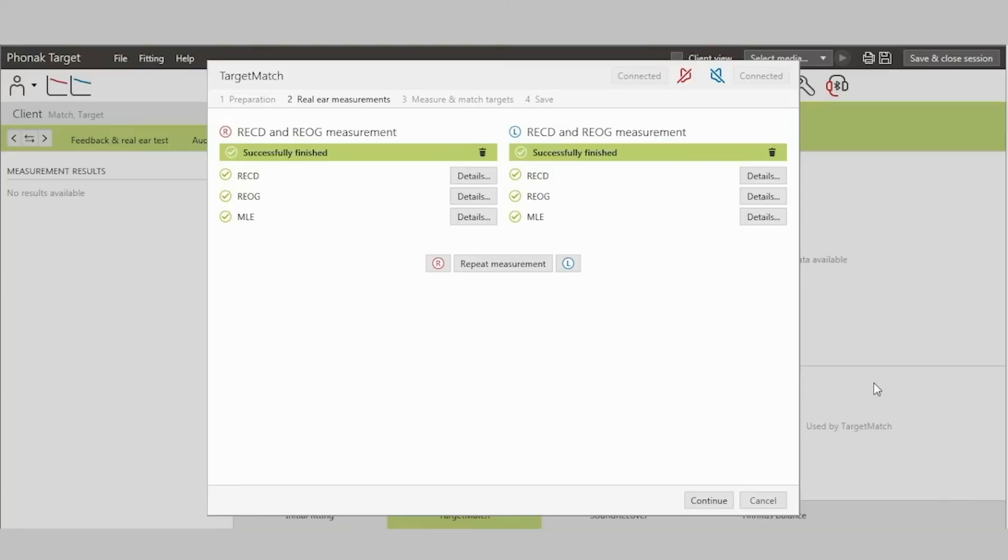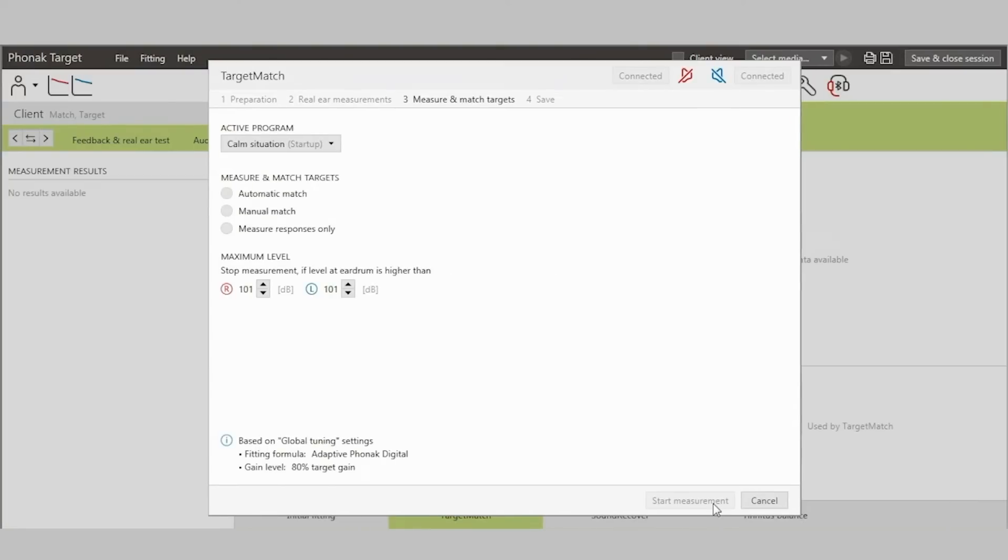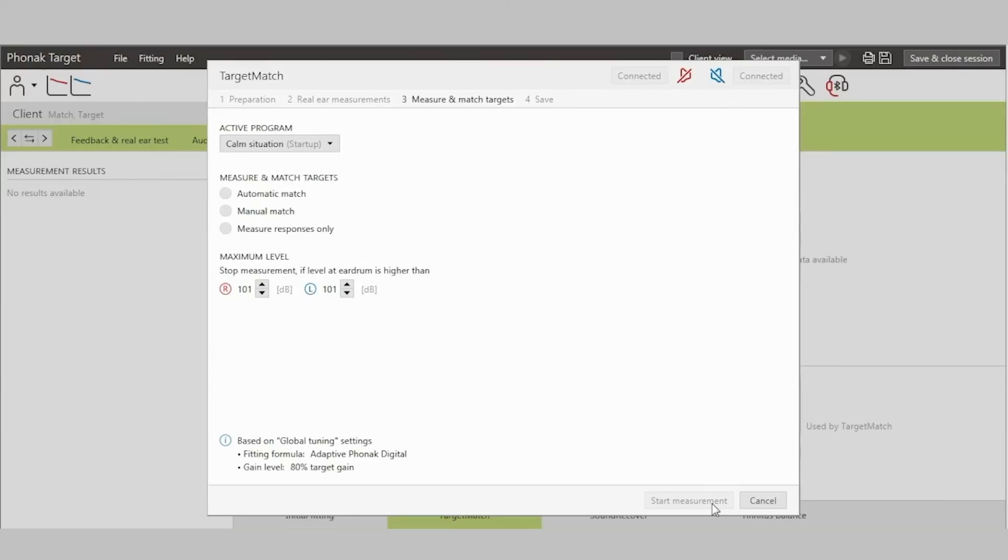The last step is to measure the aided responses of the hearing aids and match them to predictive targets for three international speech test signals, ISTS, at 50, 65, and 80 dB. Targets can be from any standard prescriptive algorithm such as NAL or DSL or a proprietary algorithm such as Adaptive Phonak Digital. Targets can be matched automatically or manually. This process of measuring and matching is automatically done twice along with ambient noise measurements for accuracy and reliability.